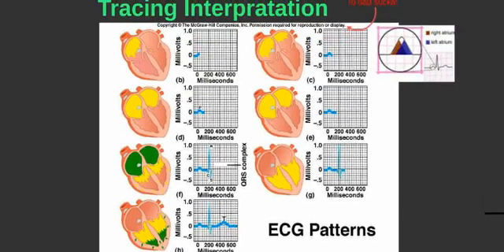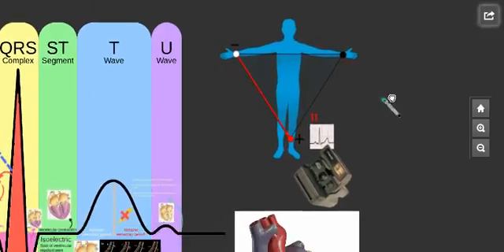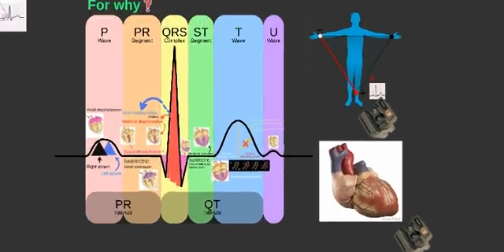Now that's a quick down and dirty interpretation of it. Now we're going to dive a little bit deeper into it for the next couple minutes. So some things to keep in mind when we look through this. We are looking through lead 2 because it's just the standard of how everybody sees it. And this is the correlation of how we're actually picturing the heart, how we're looking at the heart, and how this tracing is being interpreted. Because remember, it's different in all the tracings that we talked about before, that every little picture is different. This is just the more common one that we utilize.